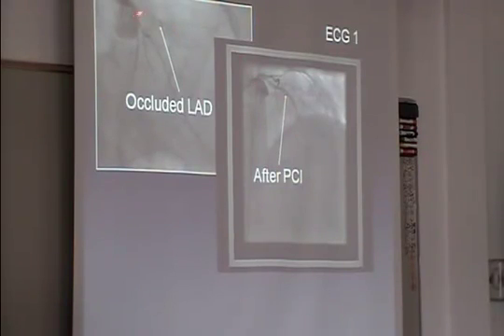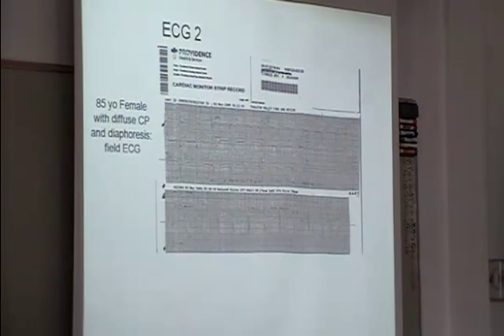And actually I guess this is the thread of the LAD right here. And after angioplasty, you can see that artery was restored. Some of these are a little hard to see. So this is an 85-year-old female, diffuse chest pain, diaphoresis.